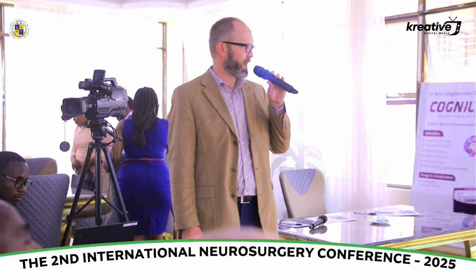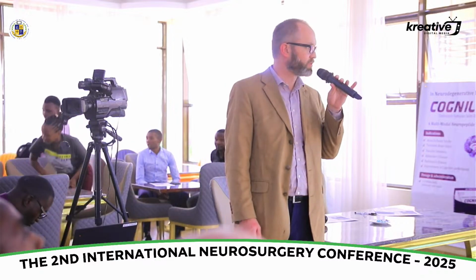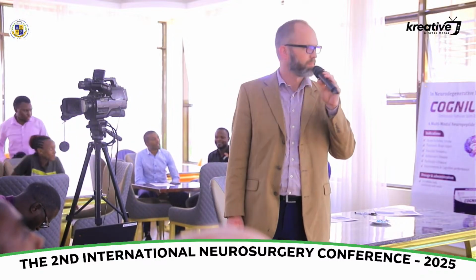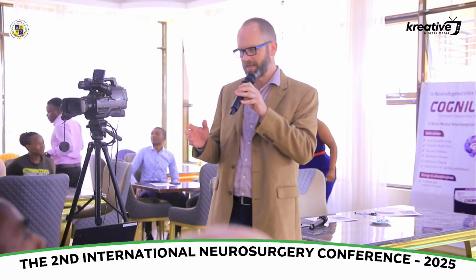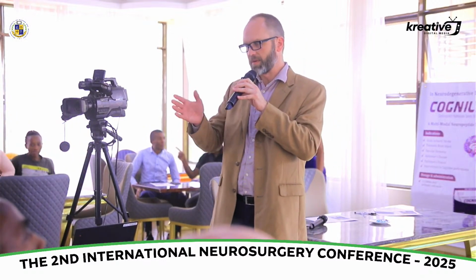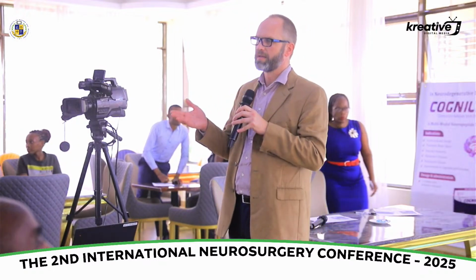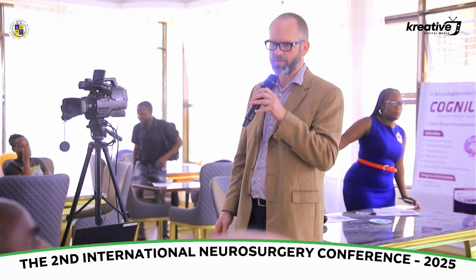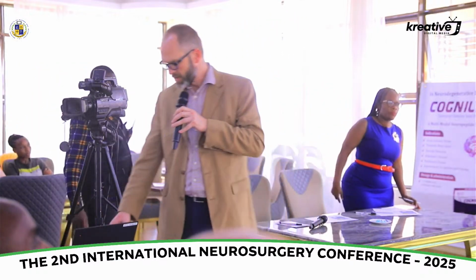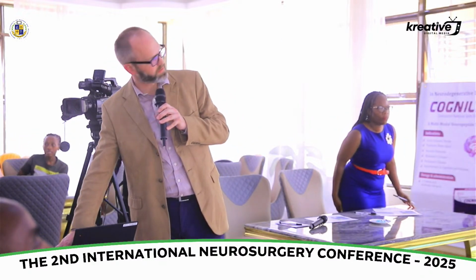Color Doppler adds directional information to blood flow imaging, and with power Doppler, you lose directional flow information, but you can image smaller vessels. I'll talk about it a little bit, but you need to be parallel to the blood vessel you're trying to image to get accurate velocity information, and with power Doppler, you don't have to do this. So there's settings where it's useful to use one or the other.